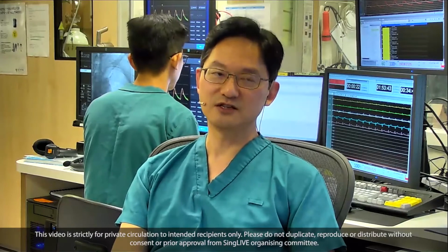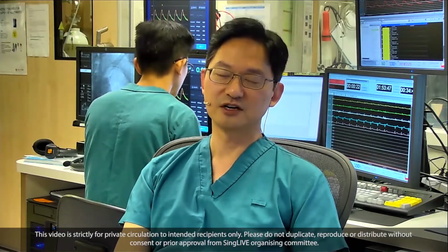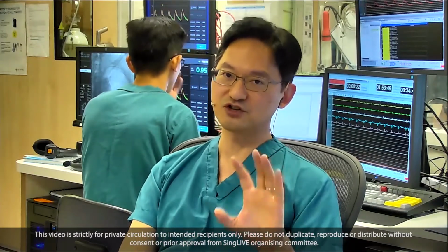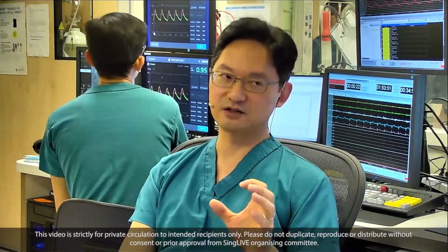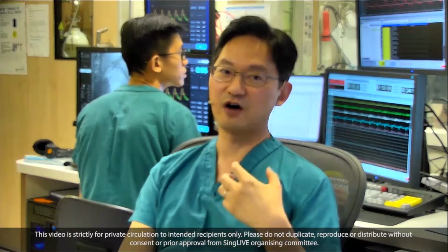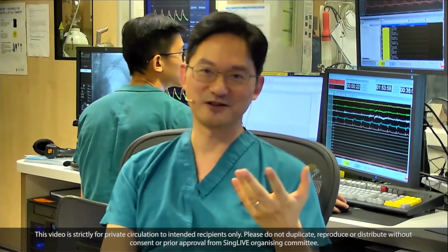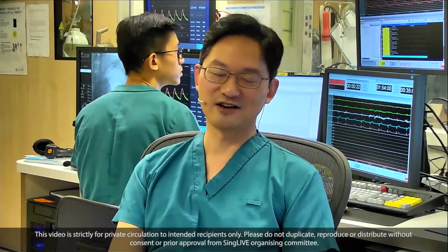But immediately, as we speak in 2020, the huge advantage for the patient is probably more on the precision of positioning the stents and minimizing overlap. But for us, don't forget, when you don't look after yourself, you can't look after your patients. And I know of very few interventionists who don't have chronic back pain.